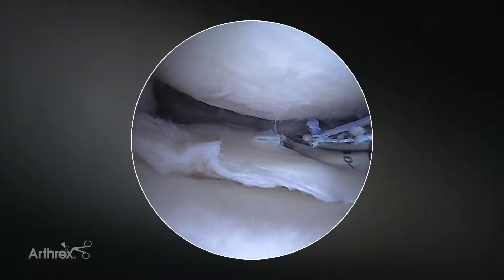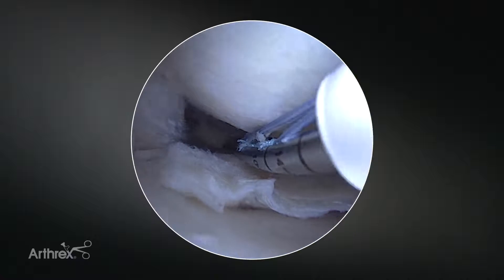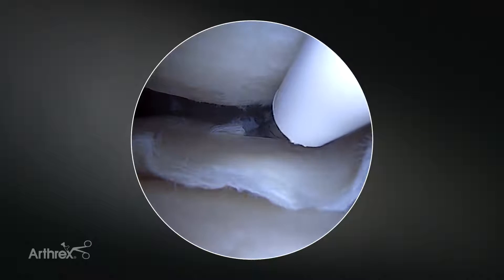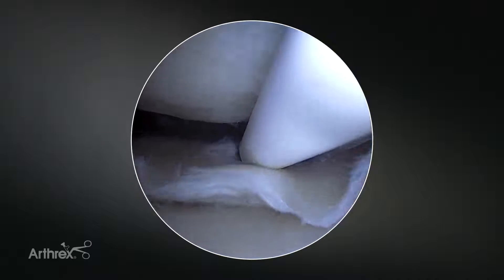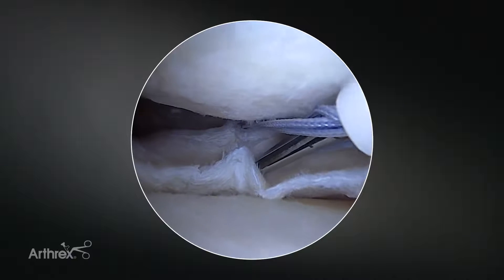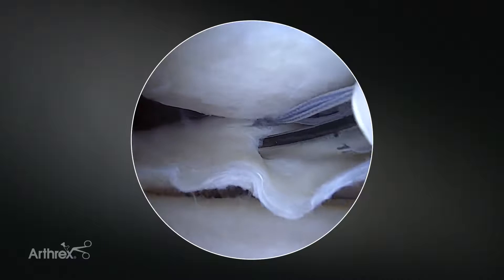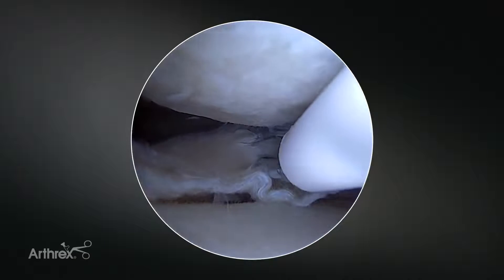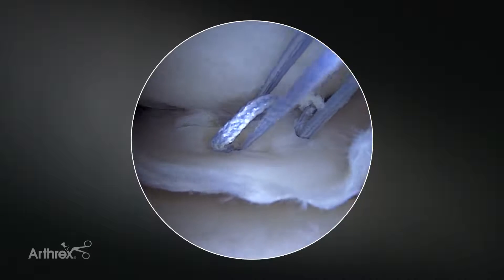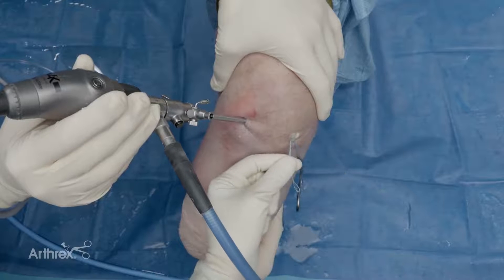This one I'm actually going to start on the capsular side, and that's a little bit of a trick. If you take this implant and go more towards the root and slide, it can help you get onto that capsular side, and then through the meniscal tissue. You can take advantage of the curve in order to get the implant through the tissue and then through the capsule appropriately. We'll go ahead and set this stitch as well.